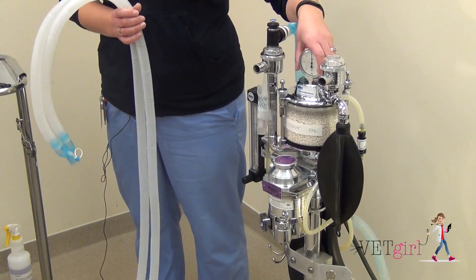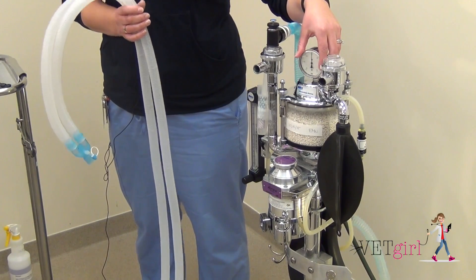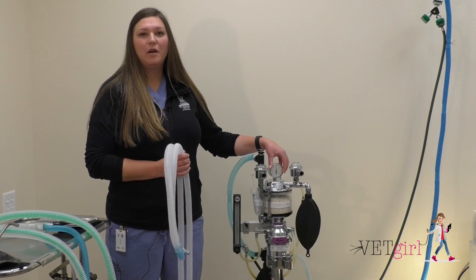Included in this machine — not all machines have this — is a pressure manometer to also identify the inspired pressure that we're giving to our patient manually.